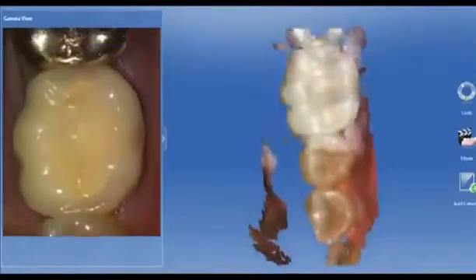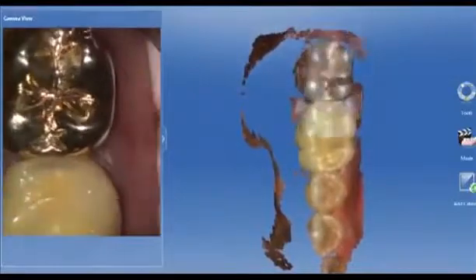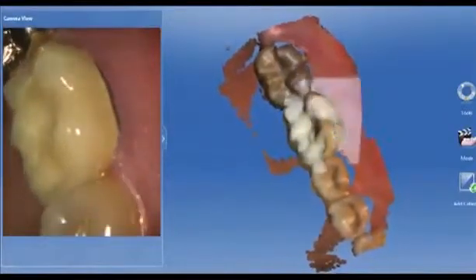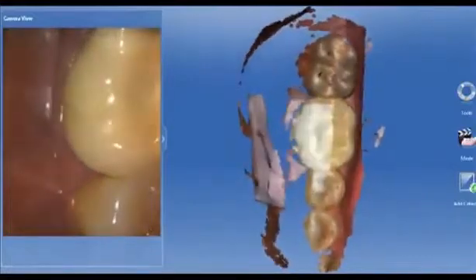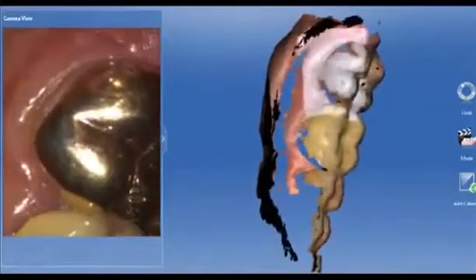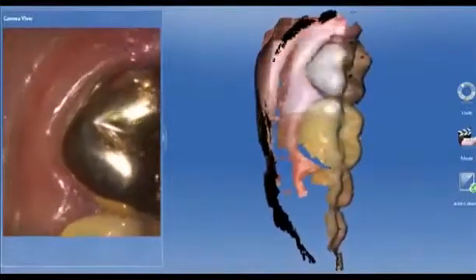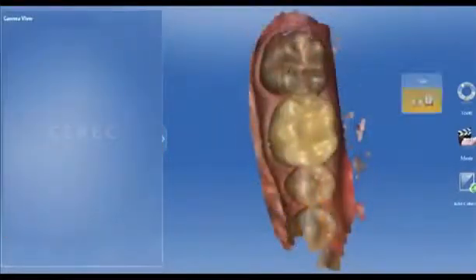As we're waiting for anesthetic, all we have to do is image her quadrant. And we do this for two reasons. One, we're going to set up the preoperative three-dimensional shape for the final restoration. That's a fancy way of saying that we're just going to duplicate the three-dimensional shape of the gold crown in a new Emax crown. But the other thing we can do with this impression is set it up to be the foundation of our final impression.